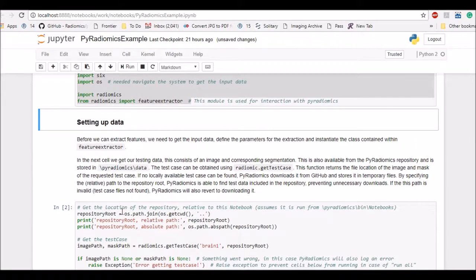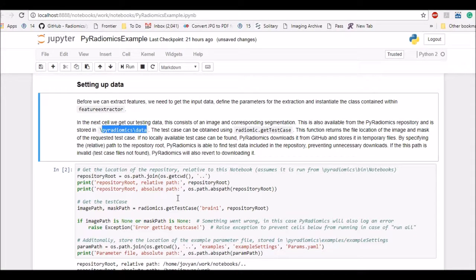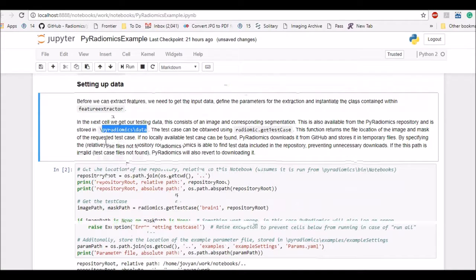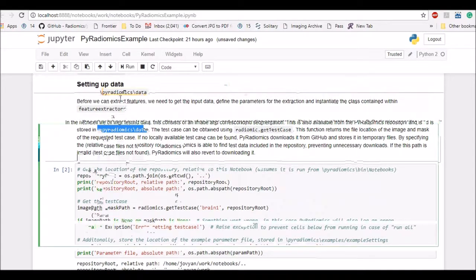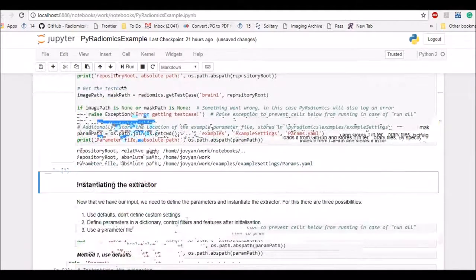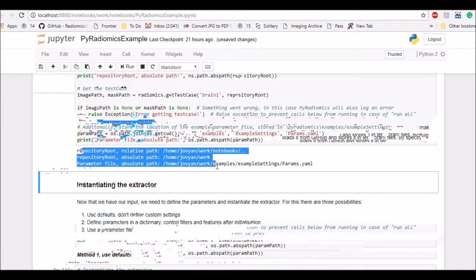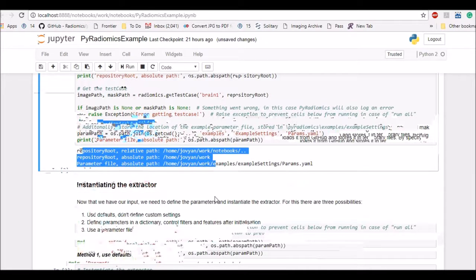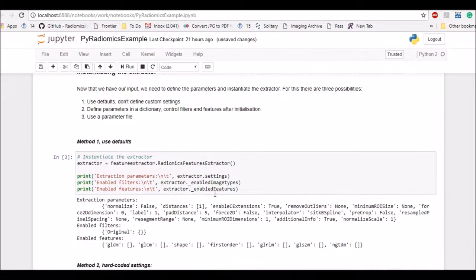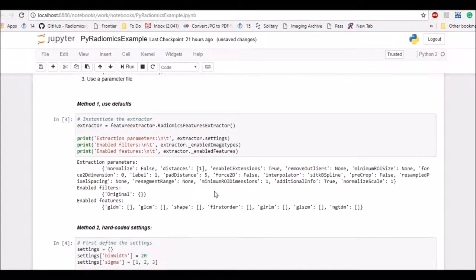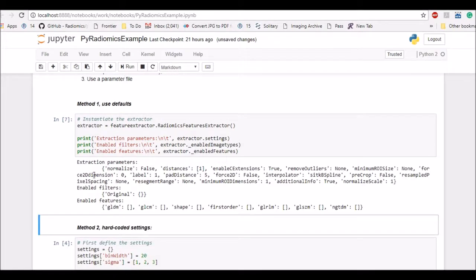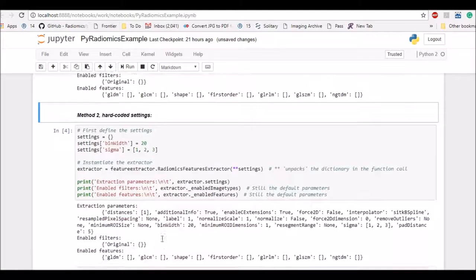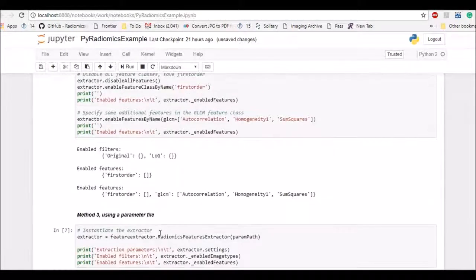Second step is to set up the data. So again the data is stored into pyradiomics data directory and here are the commands for image path, parameters path. So once you run the second command it will get all this data for the example. And in the next step you instantiate the extractors. So running that will instantiate all the parameters and so on.